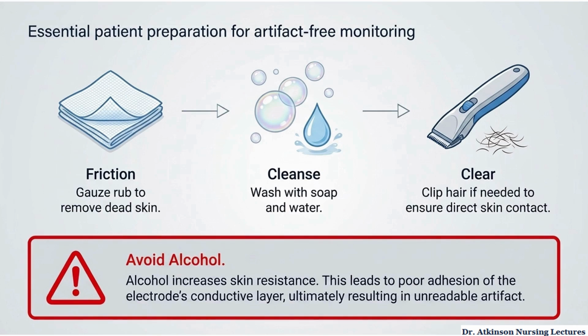Then wash with soap and water, and clip hair if needed. Avoid alcohol. It increases skin resistance, causing poor adhesion and unreadable artifact.